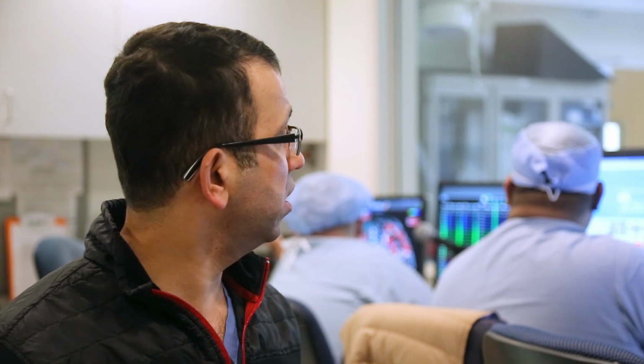Then we start the stimulation protocol, and we make sure that the blood pressure is stable. We communicate with the anesthesiologist, as Mark was doing throughout the case, and as we increase the dose of neo to support the blood pressure, we start infusion of isoproterenol, at a low dose of between 2 and 3 micrograms per minute, and we escalate this dose up to 30 micrograms per minute over 10 minutes or so, as long as the blood pressure permits, or junctional rhythm occurs. If junctional rhythm occurs, we stop the isoprel.